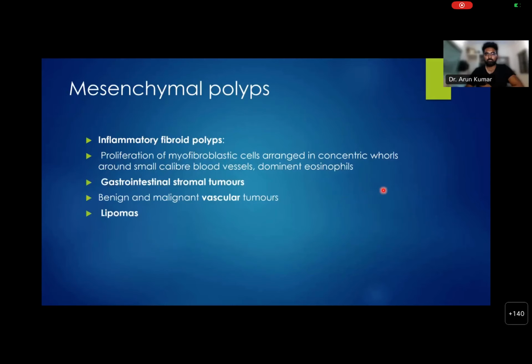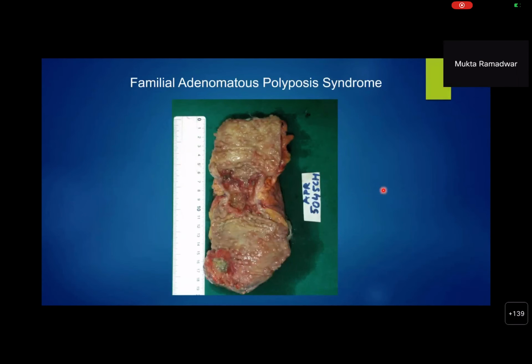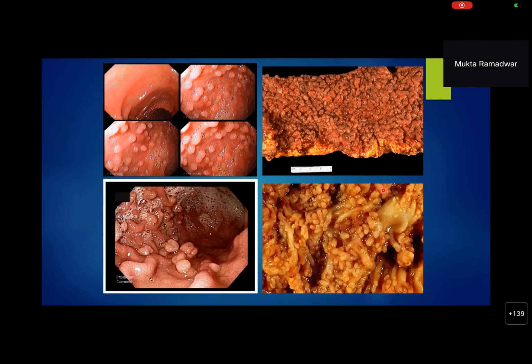Thank you so much. I actually wanted to pose this slide to Prachi and just test her. Prachi, I just collected these 4 images. I'm very sure you would know which is which exactly without the history. So the one on the right is an FAP, because it's a very typical carpet of polyps that we see frequently. The one on the left is frequently mistaken for an FAP, but is not. That is where the optical diagnosis comes into play, because the polyps are typically pale, and the adenomas are typically going to be darker.